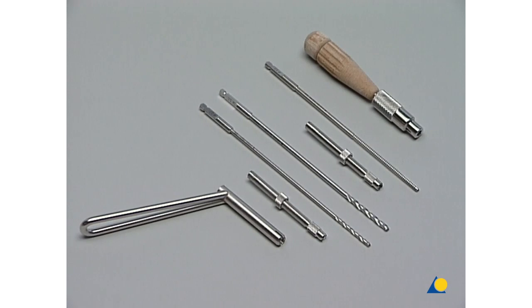We shall also need the drill guide with stop consisting of the holder for drill guide inserts, the 2.7mm drill guide insert, and the 2.7mm cannulated drill bit.